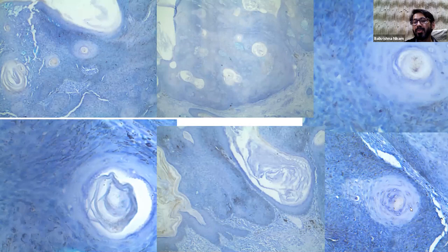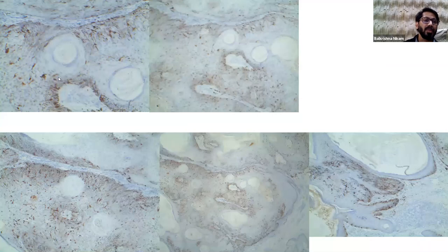So it is an epithelial cellular mass without melanin amongst the pigmented basaloid cells. The whole thing is black, and among this it comes out brightly as an epithelial mass, a milia-like cyst. The same is proved in the melanin stain. You can see the rest of the basaloid cells are pigmented, and exactly surrounding the stratum corneum or the pseudo horn cysts, you can see proliferation of normal squamoid cells of the epithelium, which appears like a milia cyst. Many times they are without stratum corneum also, and these are responsible for the milia-like cyst.